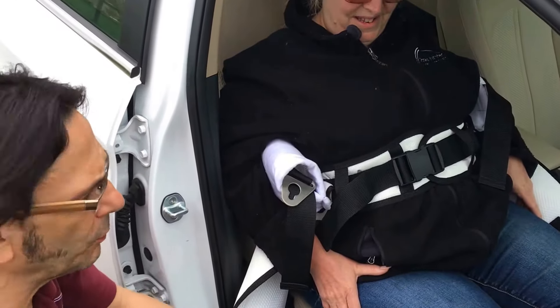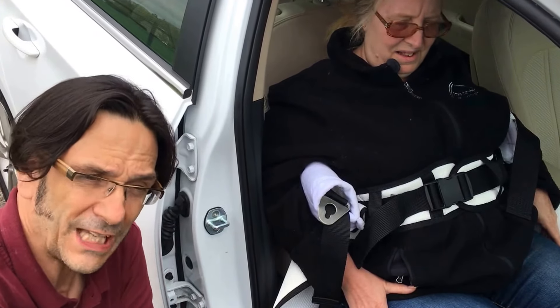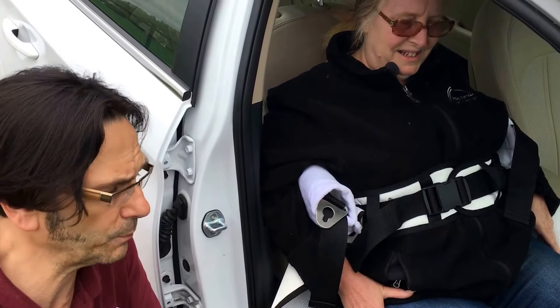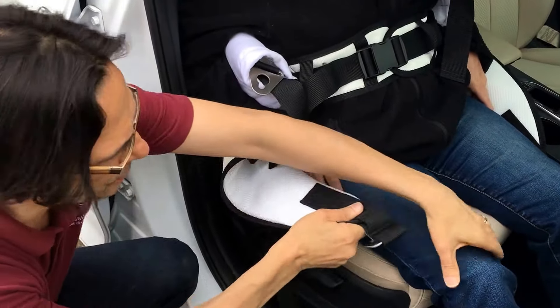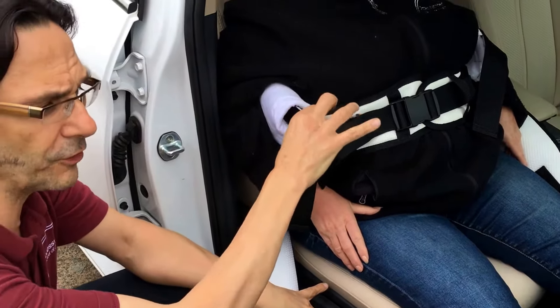It's very important to note that this setup is not going to be right for everybody. If you have a person that has difficulty with any kind of pressure under the arm, or a person who is very heavy and just can't take the weight under the arms, this is not going to be appropriate. Please make sure that you only do this if you're working with Access Unlimited and you have verified that this is going to be a good application for your particular situation. You'll notice the leg tabs, which normally on your multi-lift sling would go underneath, here we're going to have them out, because we're trying to actually lift from the upper torso.